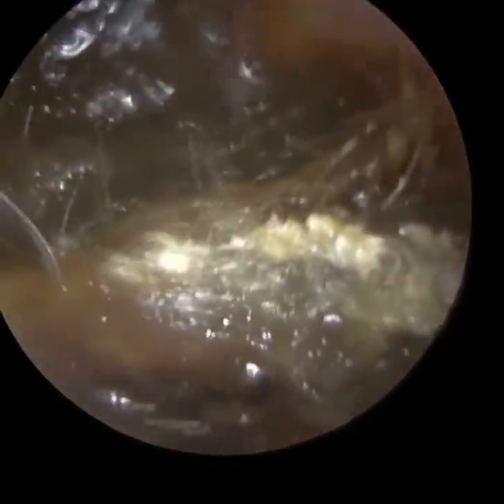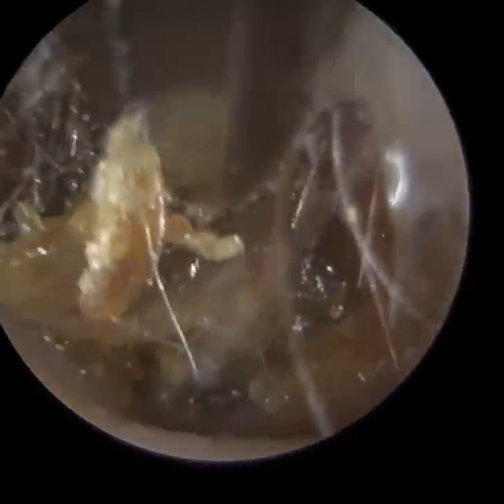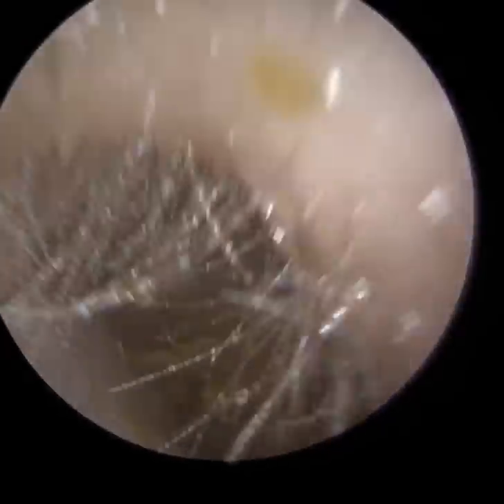Essentially with this patient, they've had a long-standing eustachian tube dysfunction. I'm just going to give you a bit of background whilst you're watching this, so it all makes sense and comes together when you see the middle ear. This patient has long-standing eustachian tube dysfunction.